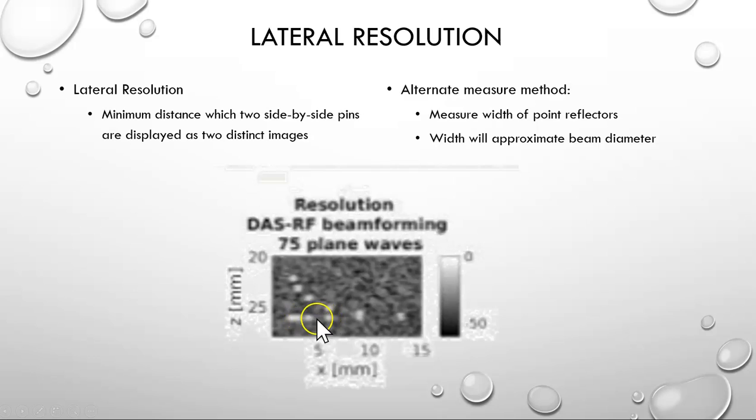Remember that lateral resolution is determined only on beam width.